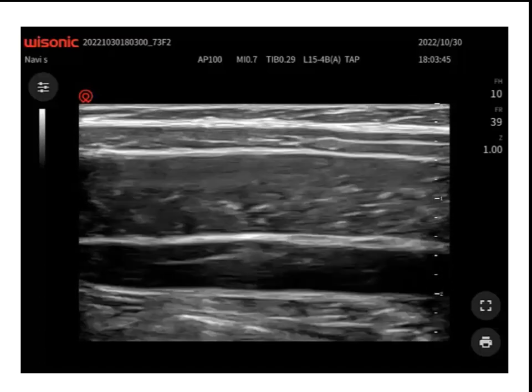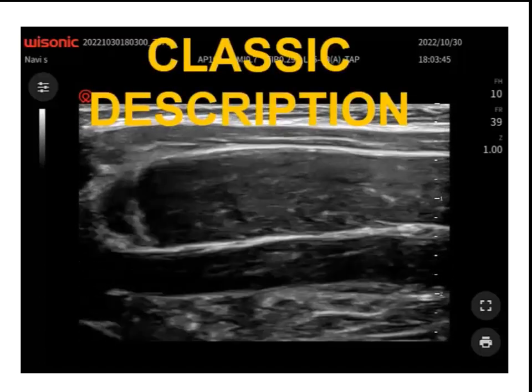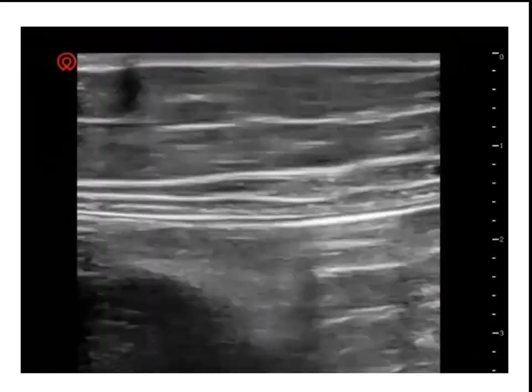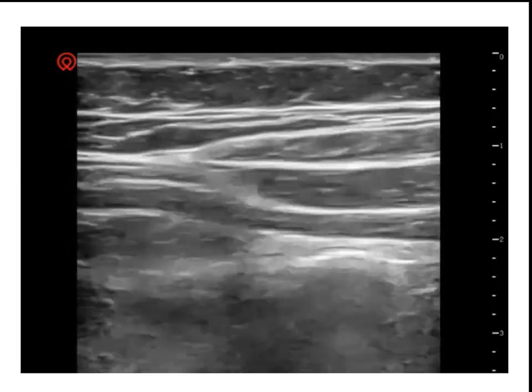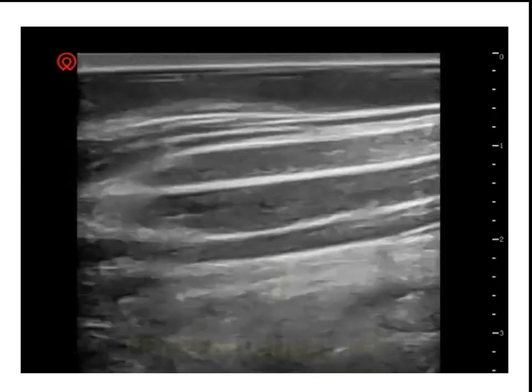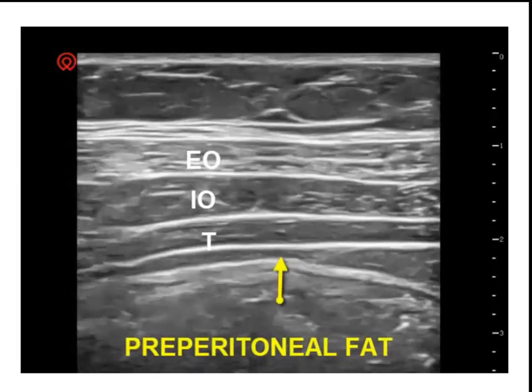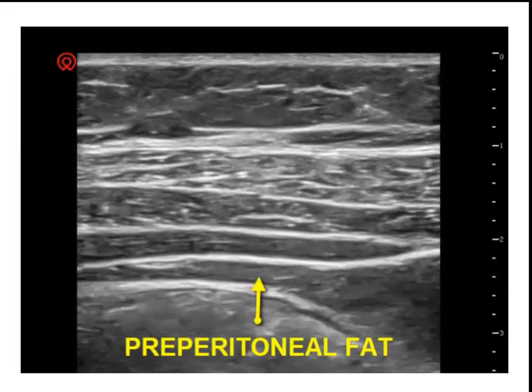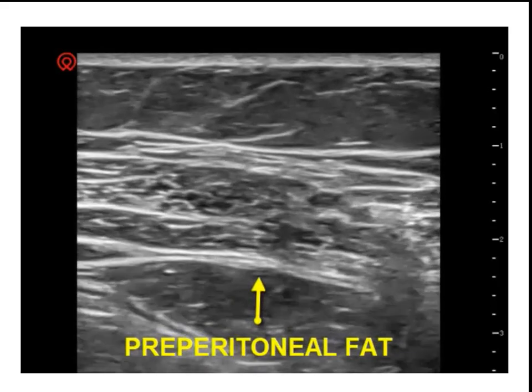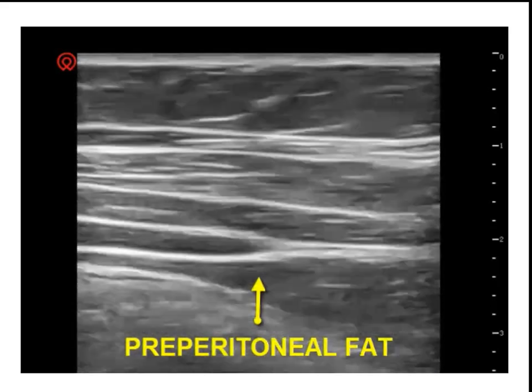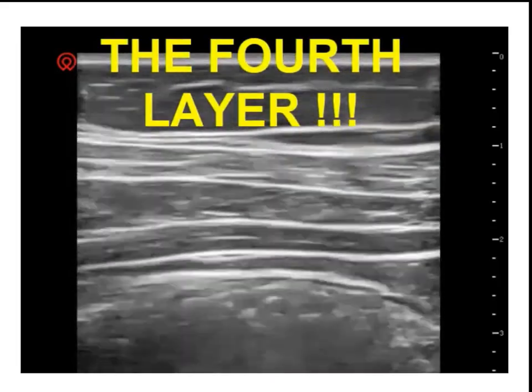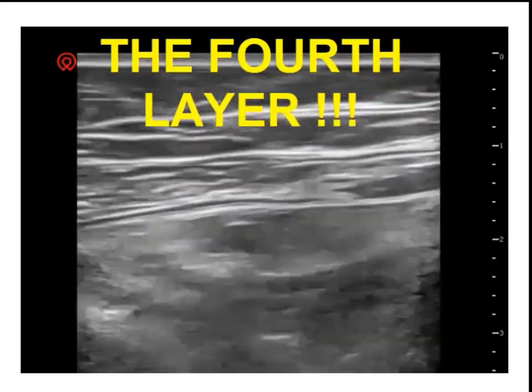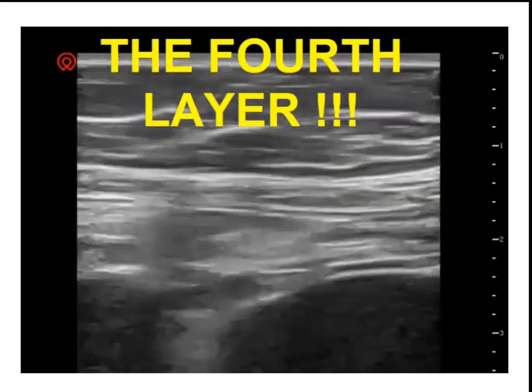Classic descriptions of the abdominal wall layers call for identification of three layers. However, in many patients a fourth layer is visible laterally: the preperitoneal fat. In more posterior scans and in obese patients, the preperitoneal fat layer can be prominent and identified as an abdominal wall layer. This layer can be confused with the transversus abdominis muscle layer.